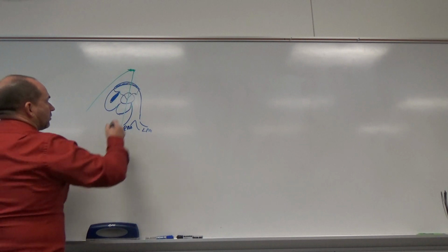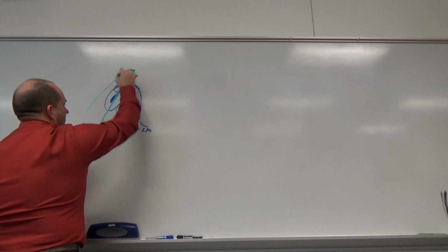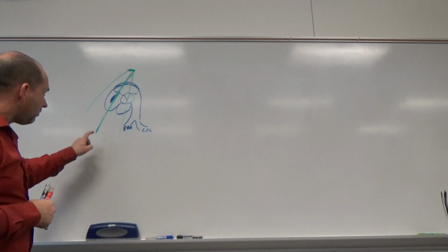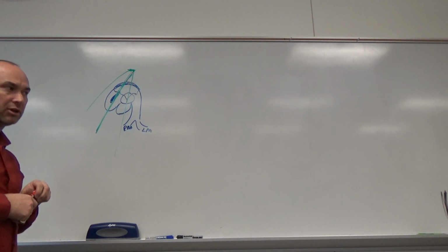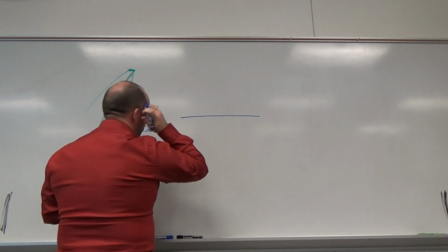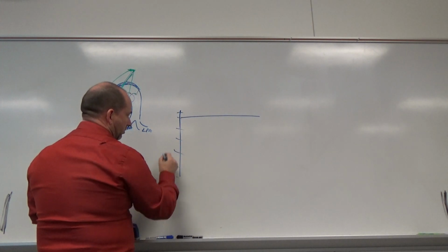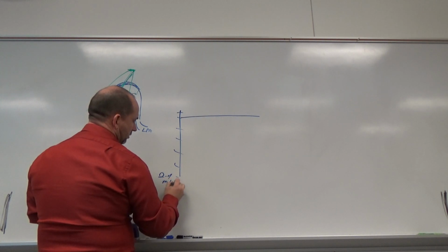Then we're going to stick a Doppler through it, just like we did. Try to get that right through the middle of it. We're going to stick a continuous wave Doppler on it, set at 2 to 4 meters per second, because we're going to repeat the same Doppler that we got on the last one. So how's that going to look again? We did that in long axis. We're going to set our spectral baseline up fairly high. So there's our scale on the side here. This is going to be 2 to 4 meters per second.